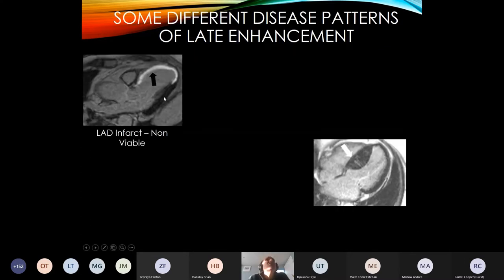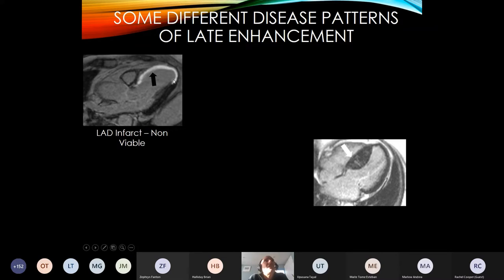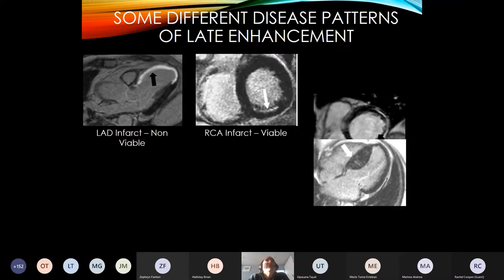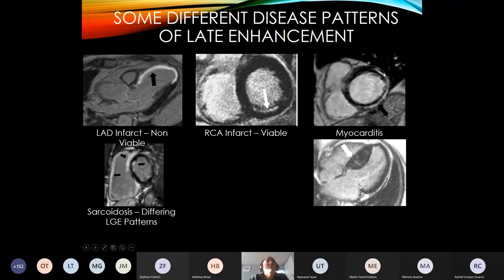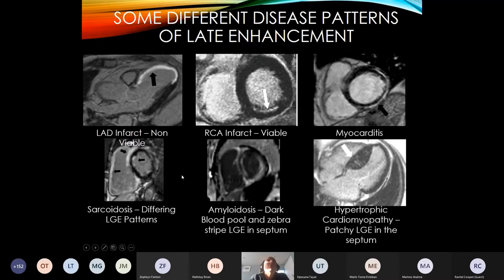What that will look like on an image is potentially like this — a three-chamber view. This is the left ventricle, the grey stuff in the middle is the blood pool. You can see the septum here is bright white and just stops — then this is all black, which is normal. This bright white area is a massive left anterior descending myocardial infarction. The differing patterns can give you a lot of information about the underlying pathological process. For example, in myocarditis the inner layer — the subendocardium — is spared, with epicardial-based scarring, which is classic of myocarditis. We'll talk about sarcoid and amyloid later.